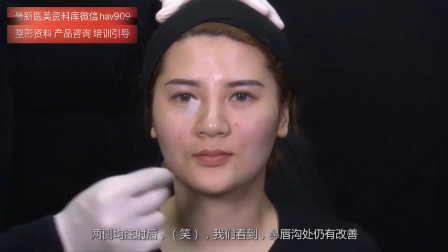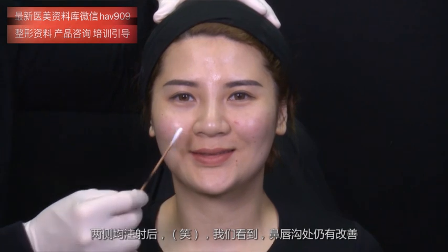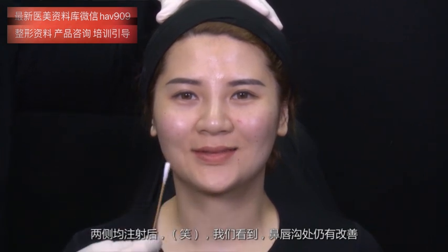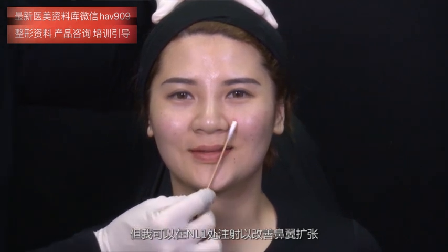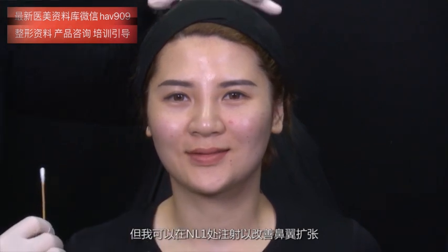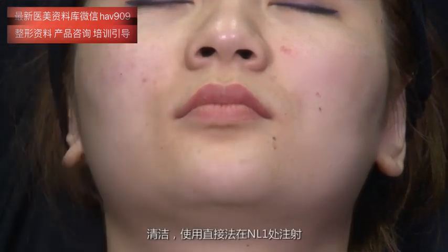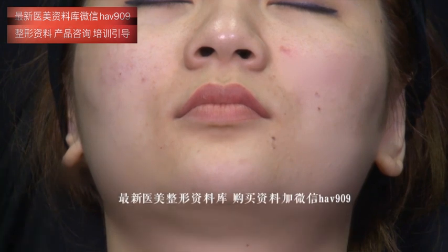Now, after treating both sides, smile, we see that we still have improvement in the nasolabial fold, but I can inject NL1 to reduce the expansion of the nasal flare. Relax. Now cleaning to inject NL1, the direct approach.